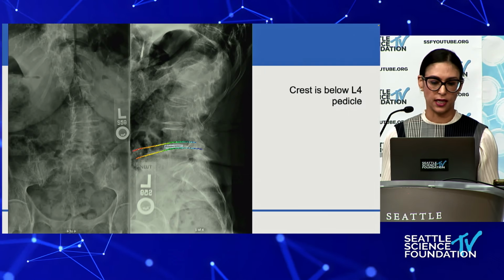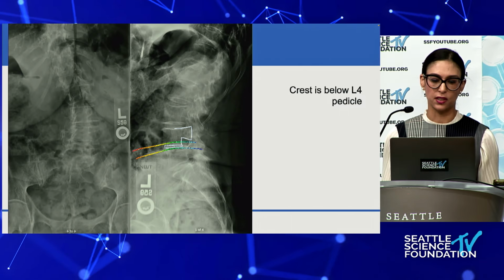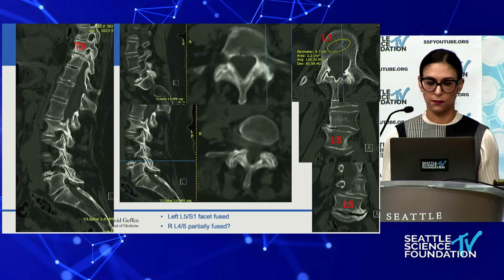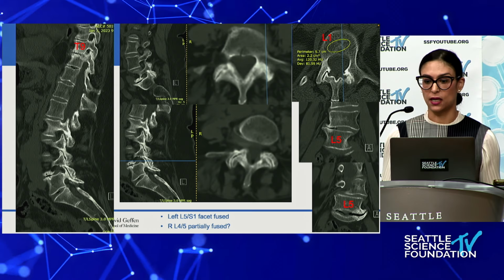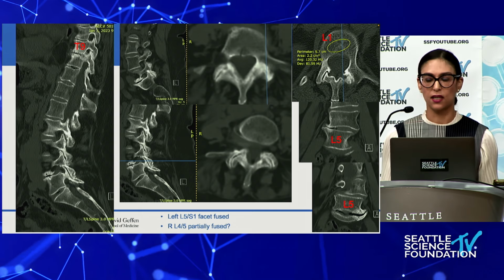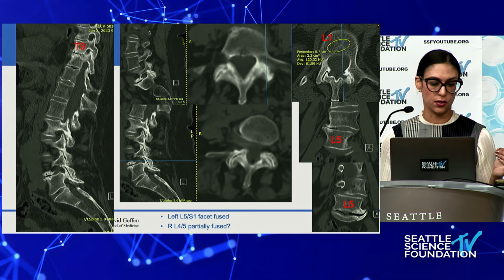And two, can I get there? Yes, because if you look at where the pedicle is, it's above that crest. So even though the disc space is potentially below it, as long as the pedicle is above it, I can usually get there. The second thing is to assess what levels need to be done. I don't believe I got a SPECT on this lady, but that's one way to see where exactly the pain generators are. You do try to avoid that L5-S1 if you need to.